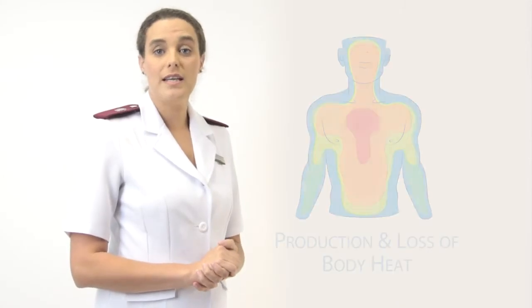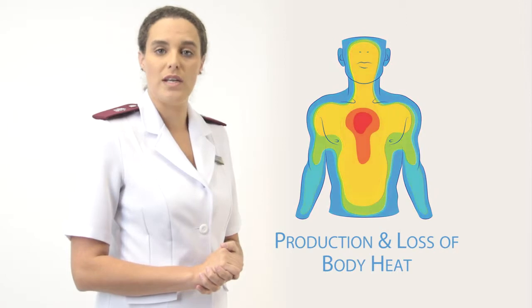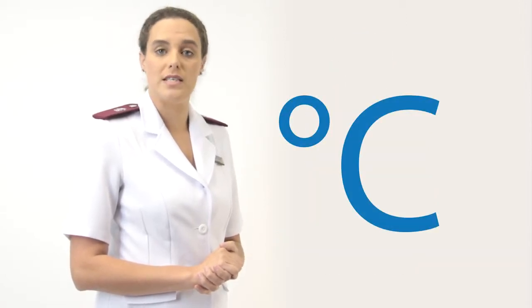Body temperature indicates the difference between the production of heat and the loss of heat within the body. In Southern Africa, we measure the body's temperature in degrees Celsius. It is important to note that most healthcare institutions have removed or are phasing out thermometers with a mercury bulb.